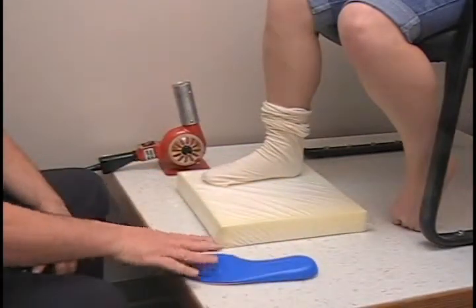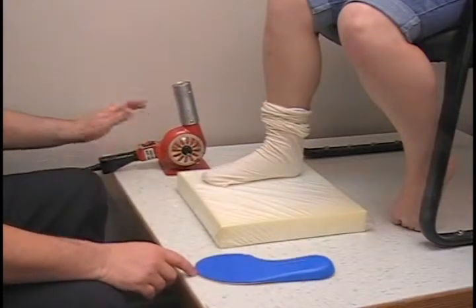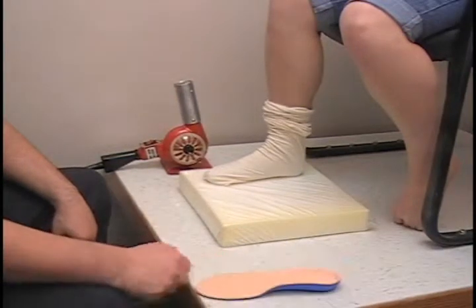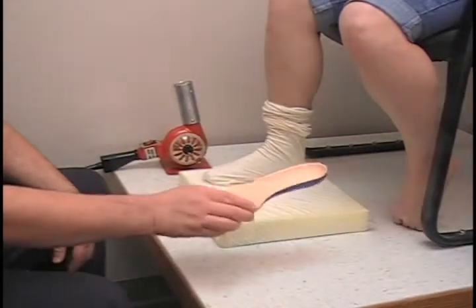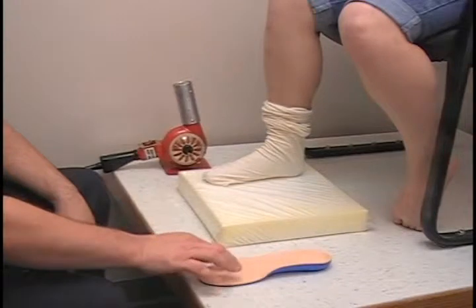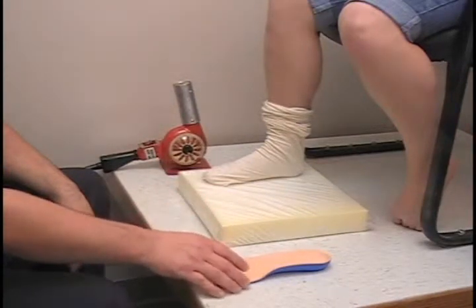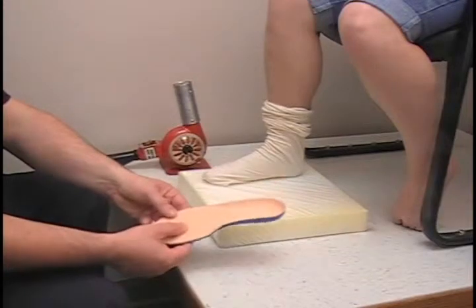Start heating on the plantar surface. If you are using a 500 degree heat gun, approximately 45 seconds on the bottom and 45 seconds on the top. From there you are going to want to touch it to make sure that it is warm enough — you will leave a fingerprint on it — and also that it is not too hot for the patient.